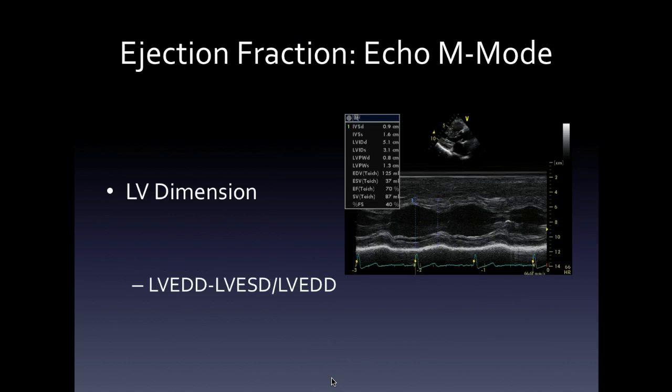However, using that, you can come up with a fractional shortening method, percentage fractional shortening. In this case, the left ventricular ejection fraction, I calculated incorrectly, by the way, at 70%, because I don't think I put the cursor in the right spot. I actually think that probably should be there. Okay? But it's relevant and it's a useful way of checking.